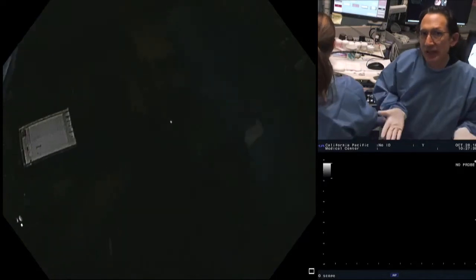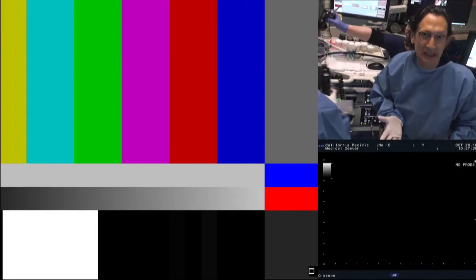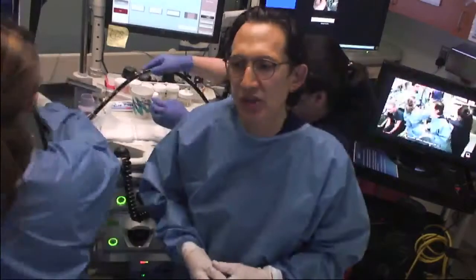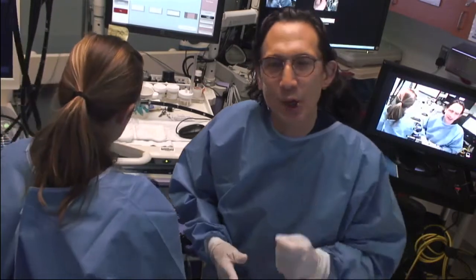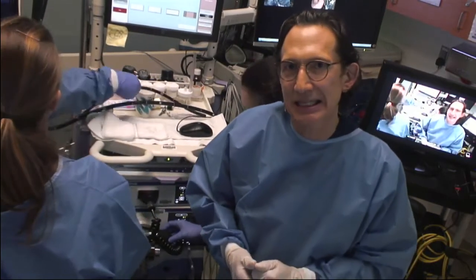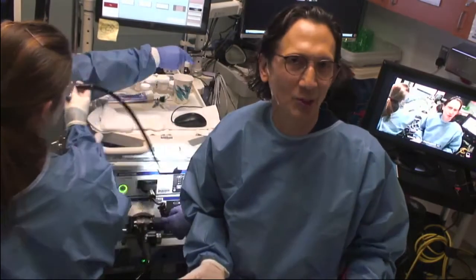Now we're going to switch to our echo endoscope. And we can use a diagnostic echo endoscope because we're not placing any large diameter devices through this. We're going to use a 19-gauge needle, standard FNA needle, to puncture the varices. So either the diagnostic or therapeutic. Now, the only reason why you might want to use the therapeutic is in the event of bleeding, you certainly are going to get better suction through a therapeutic.